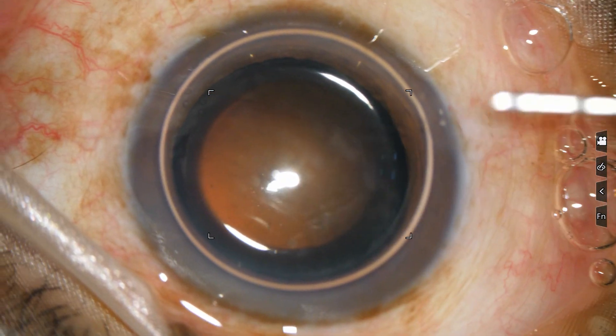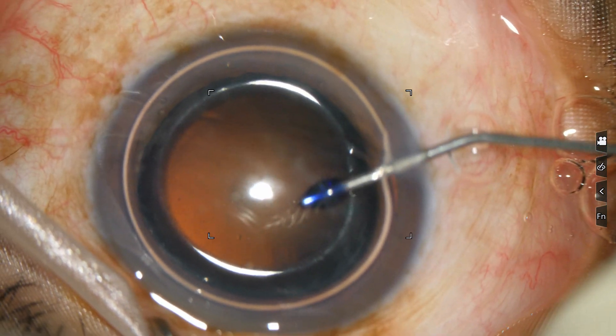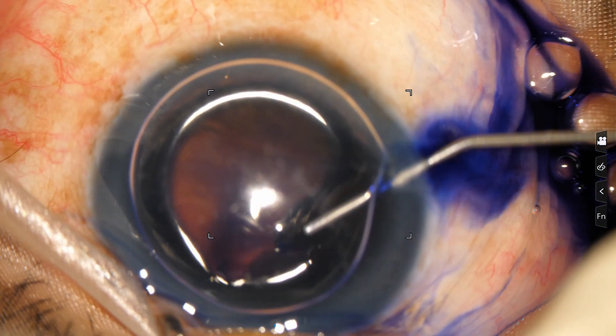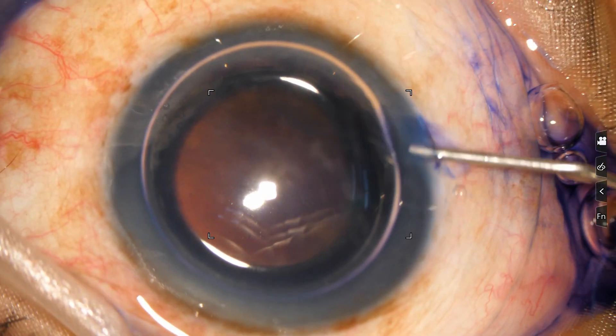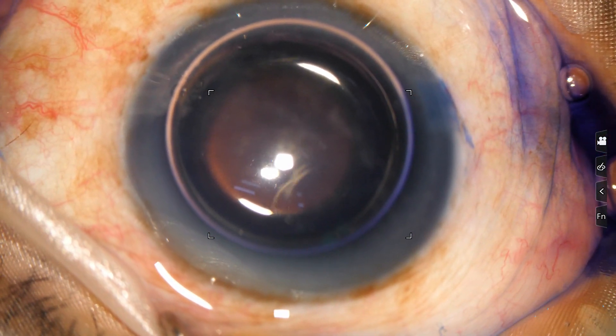Now inject dye over the capsule all around here — at the middle, at the lower part, all parts. You can inject some adrenaline. You can wait for 10 seconds.